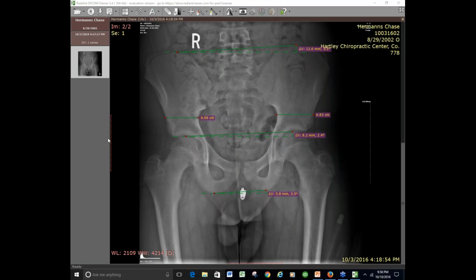Yeah, that's a great question. Because there are people you can't get to stand straight, and then there's a question of, if he can't stand straight, do I want to correct him to standing straight, because he's not going to be able to do that, right? And so there's where you're playing a little bit. I would probably have him stand normally, whatever normal is for him, and get his feet as approximated to equal to each other as you can, and you might correct to that.